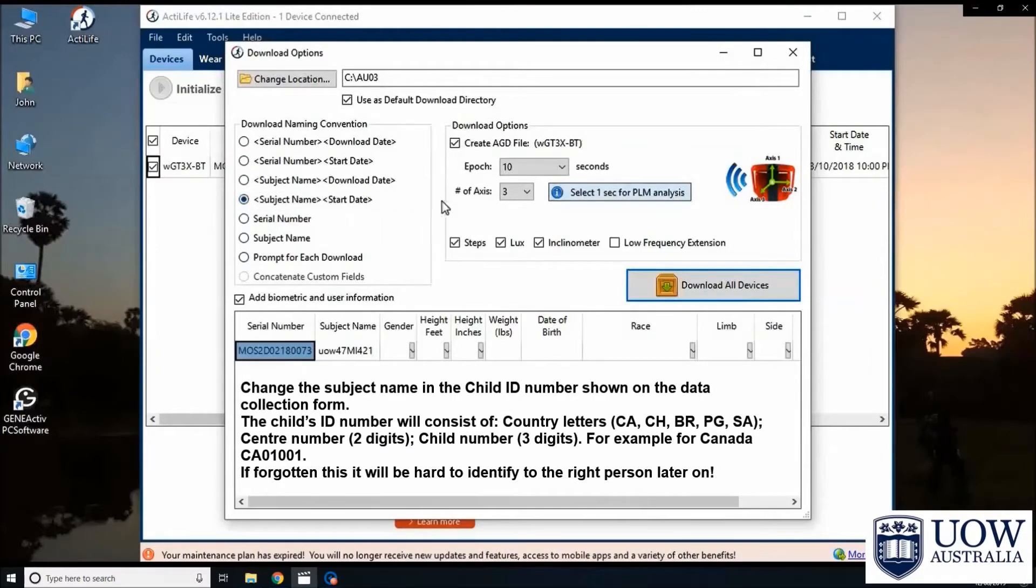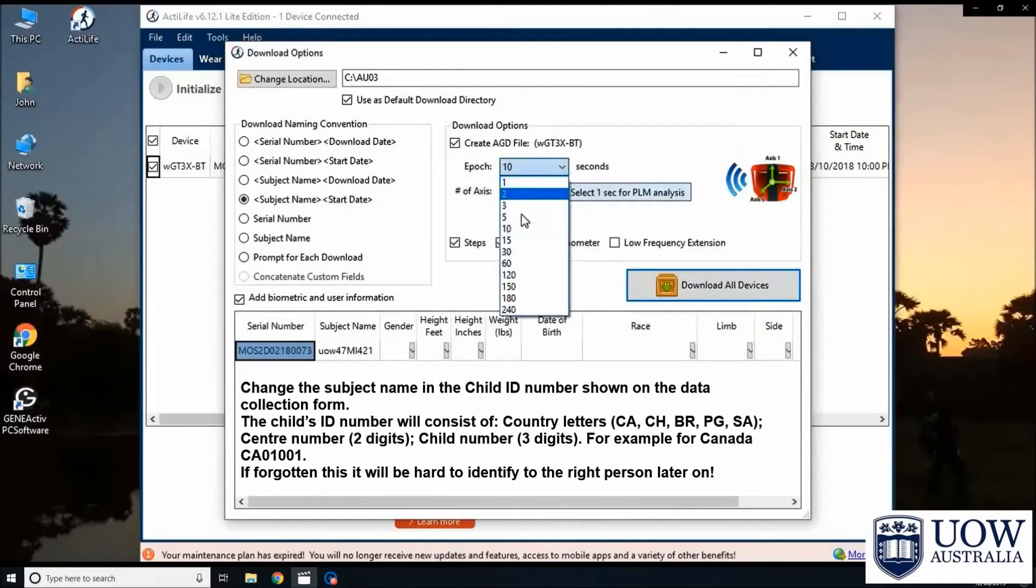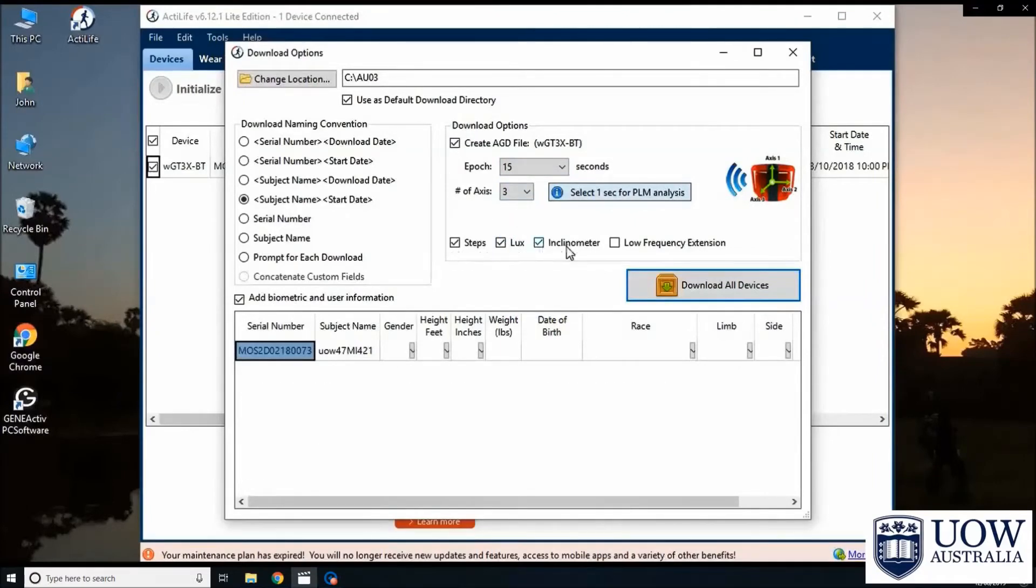Under the download options, check the box for creating AGD files. Select 15 second epoch and 3 for the number of access. And check all the options for steps, lux, inclinometer and low frequency extension.